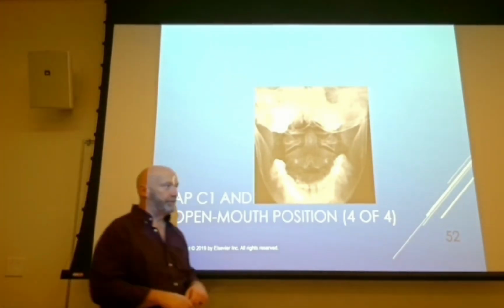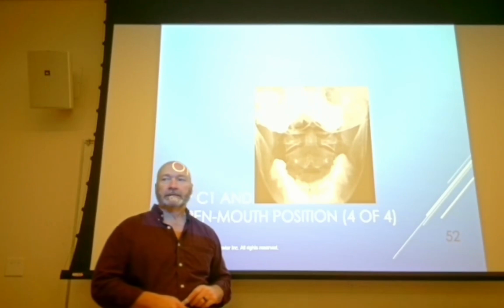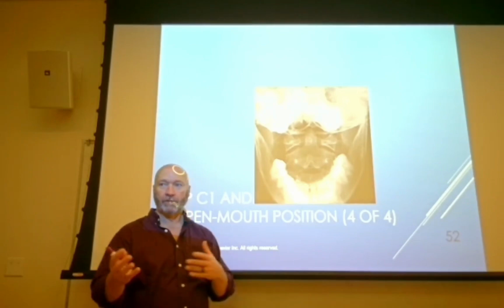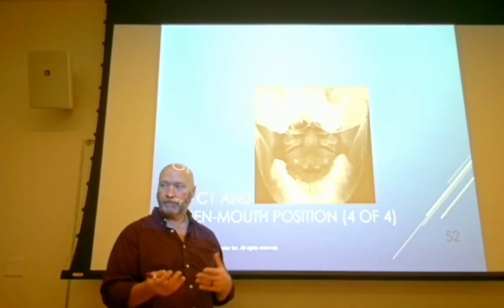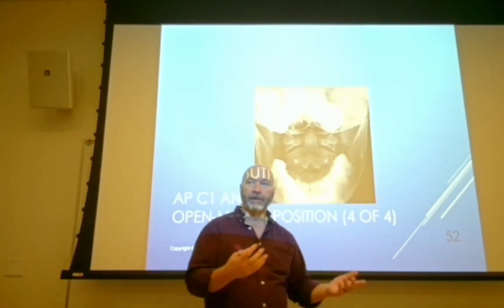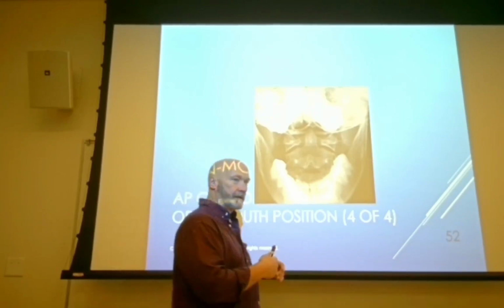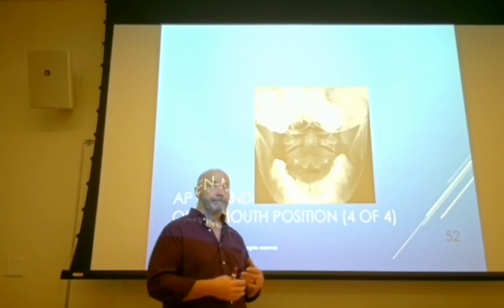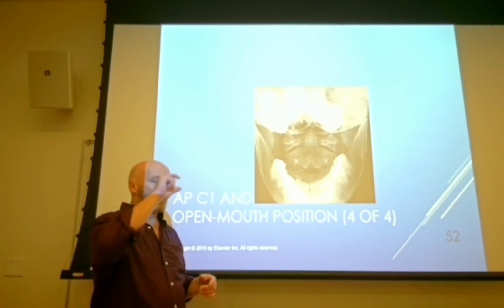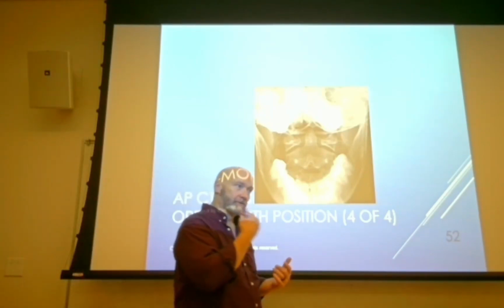Sometimes, especially if you've got a patient who can't open their mouth very wide, then we can do what we refer to as an autotomo, okay? And tomo is short for tomogram. So CT, right? What that means is moving x-rays. X-rays that move for a specific reason. You remember when we did the transthoracic humerus and we had the patient move, breathe? Same principle here. If the patient's in a collar and they can only open their mouth this wide because the collar is right there, then we can do something different and we can get those lower incisors out of the way.